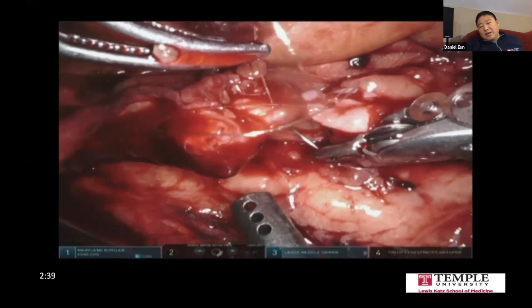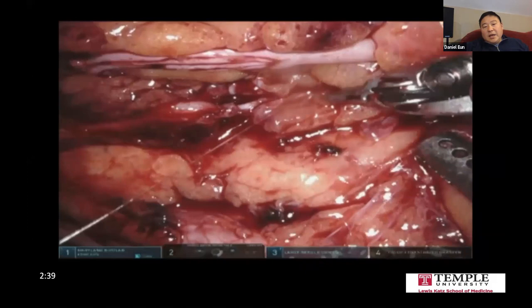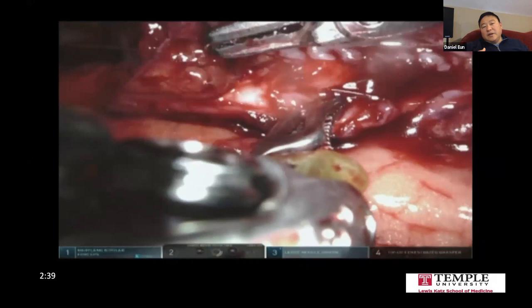So I spatulated anteriorly on the ureter. And then what we're going to do is unzip the appendix, because I can't tell exactly where I'm going to be able to use it if I have enough length here. So instead of taking a chance, we're just going to unzip it and do an onlay. By augmenting the back wall together, we're just going to roll the appendix on and onlay it on the anterior surface. And you can see here's a suture line along one edge of the anastomosis.